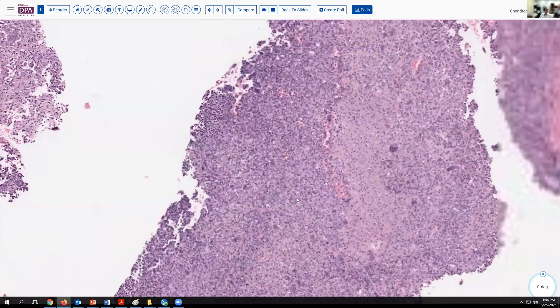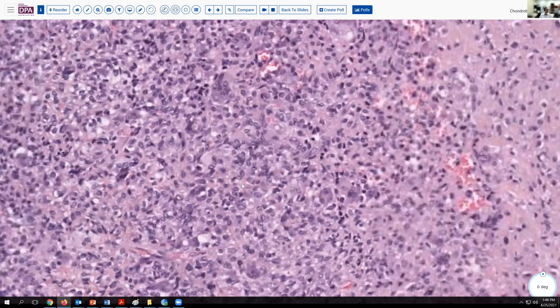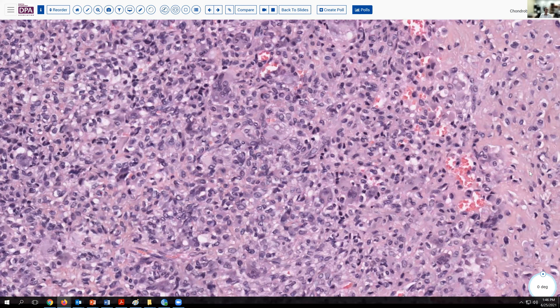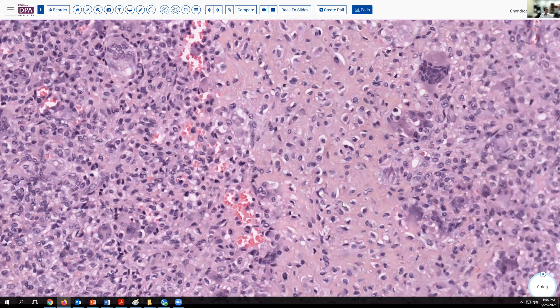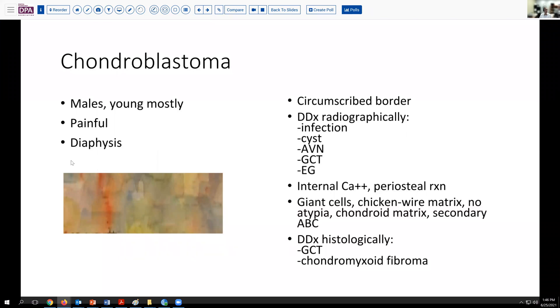Here again we see the contrast between the cellular lesional tissue — it can look a little concerning, but no mitoses, no atypical mitoses — and this more chondroid type matrix without evidence of osteoid formation and admixed giant cells. The tissue looks consistent with chondroblastoma. These clinically are usually young males, and they are often painful. Radiographically, the differential diagnosis includes infection, cystic lesions, avascular necrosis particularly if it's up in the proximal femur, as well as giant cell tumor, and occasionally eosinophilic granuloma.